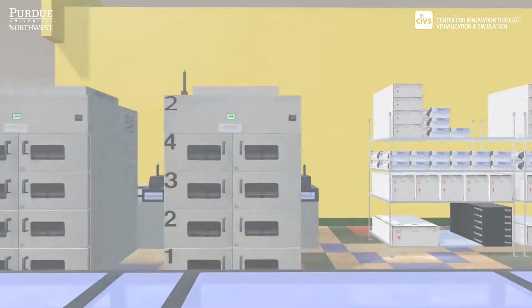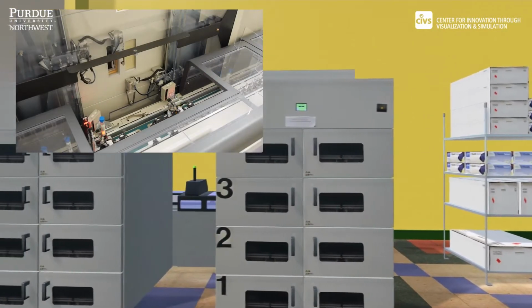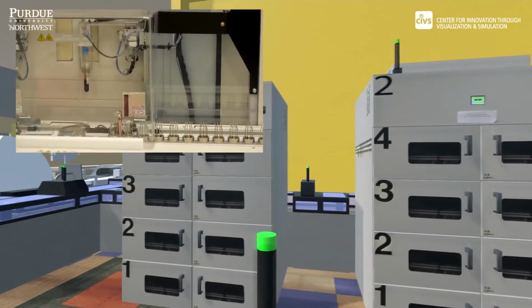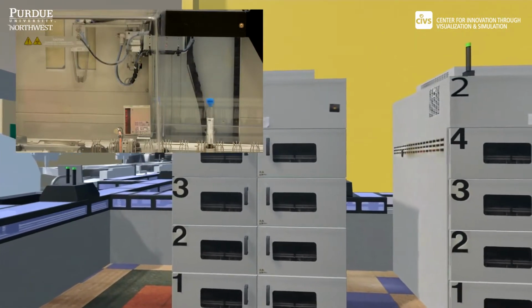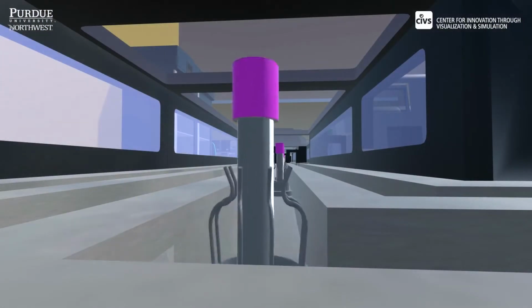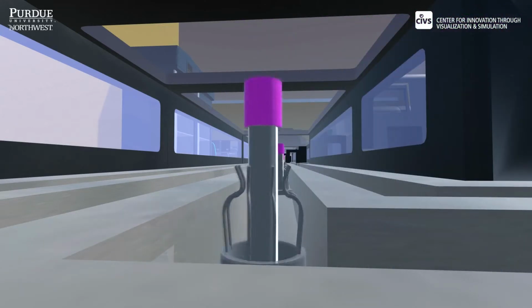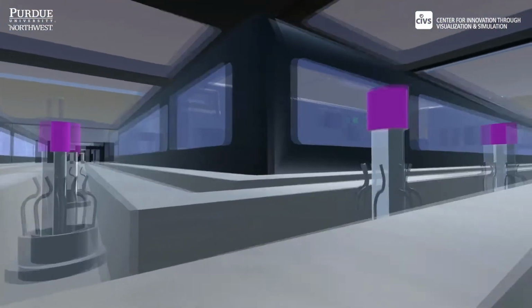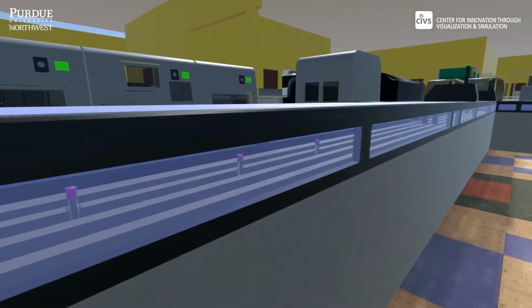It has the option to archive the completed specimen in the automated stockyard, and when a physician wants to add on a test to that sample, it can automatically retrieve the sample for further testing. Once a sample is placed on the automated line, it does not have to be touched again. As the sample moves along the line, it already knows its destination. It may proceed to the automated hematology area if a complete blood count is ordered. The science of hematology may help the doctor find an infection or diagnose a patient with anemia or leukemia.